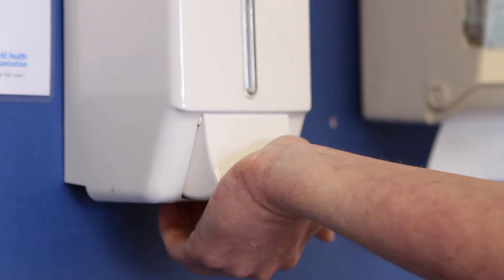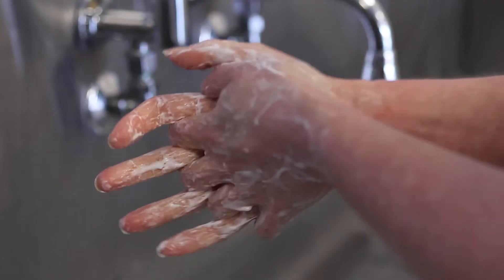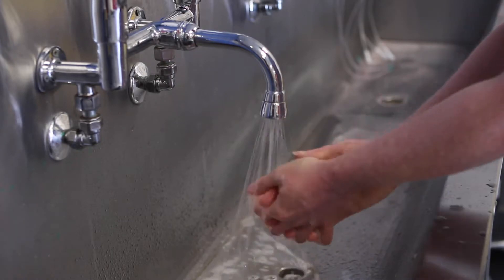It is vital that you wash your hands before and after touching the urinary catheter in order to reduce the chance of infection.